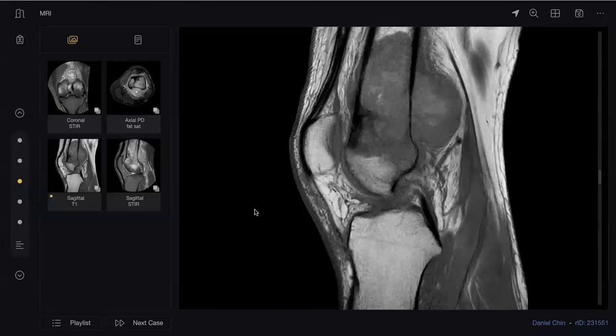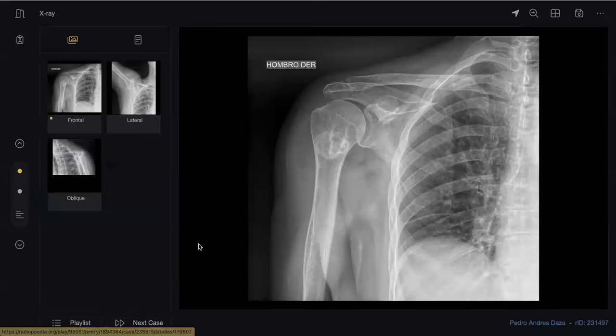Good. You did good. But this is a classic exam case, but you have forgotten to mention the pathological fracture. It is not there, but you have to mention it. Next candidate. Thank you, doctor.